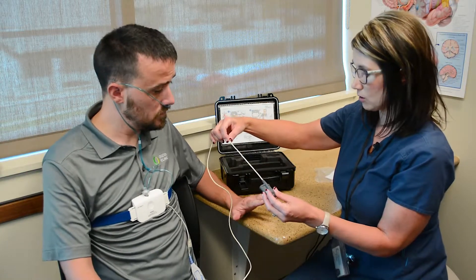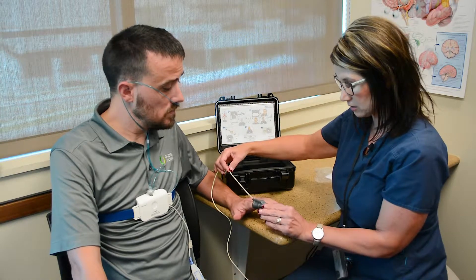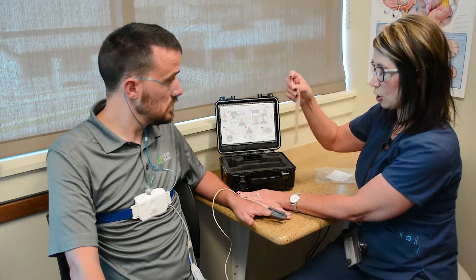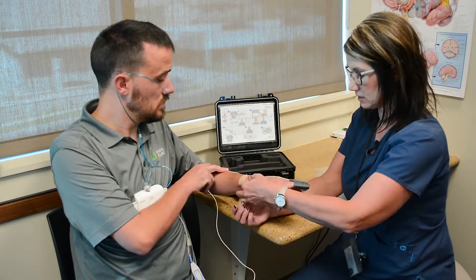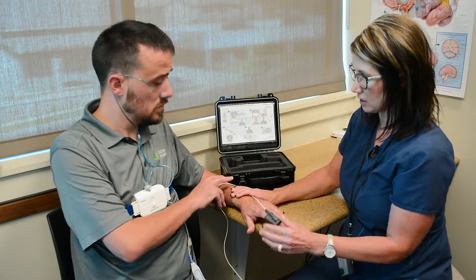We also want the cord to be up on top. You're just going to slide this over your finger until it hits the end. We also have two pieces of co-band here, one for each night. What we want you to do is take that and wrap it around your wrist to help secure that it isn't going to come off during the night.